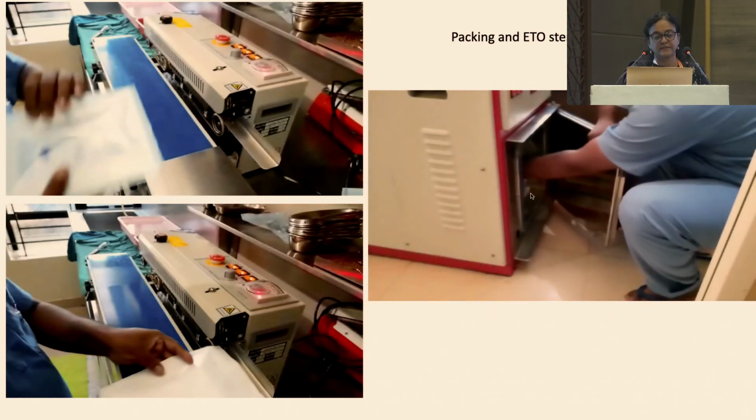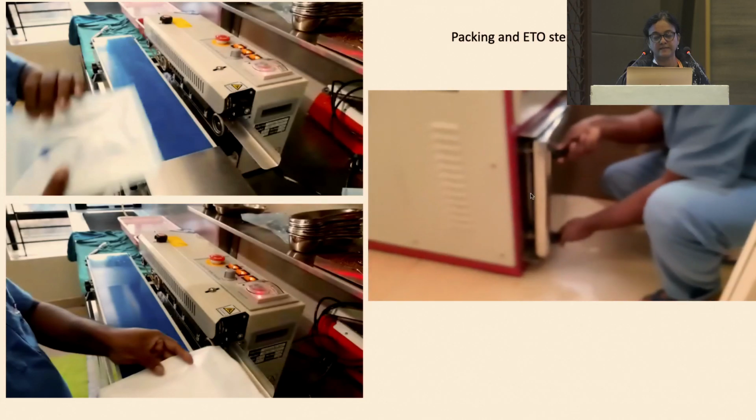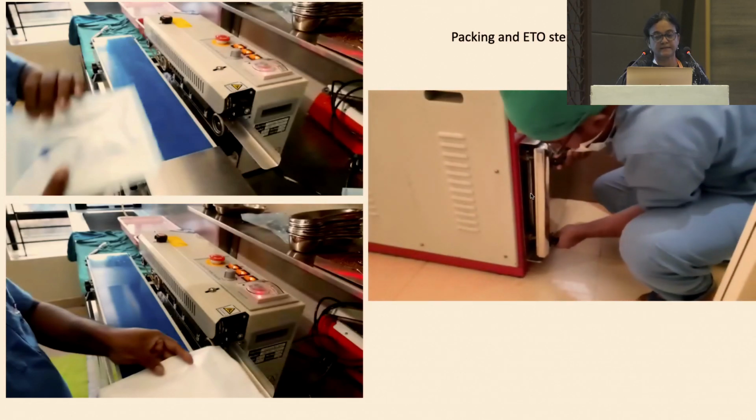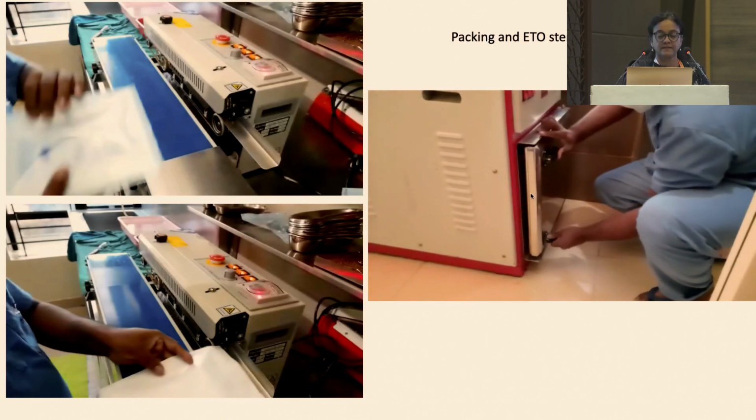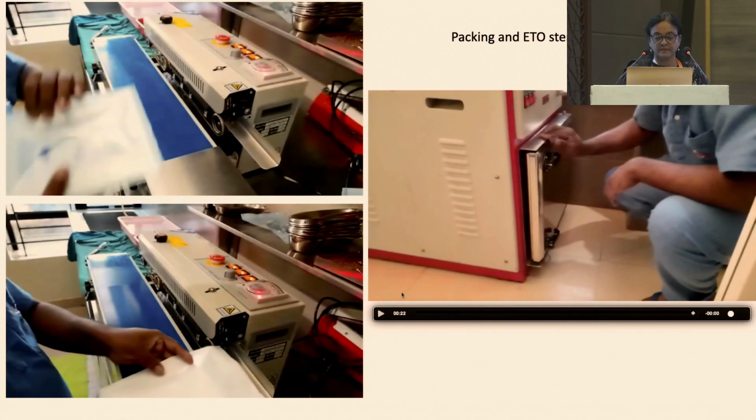So it undergoes the ETO cycle, and once the ETO cycle is complete, then the cutter can be used after the standing time is completed. So this is about the presentation regarding the vitrector and the sterilization.